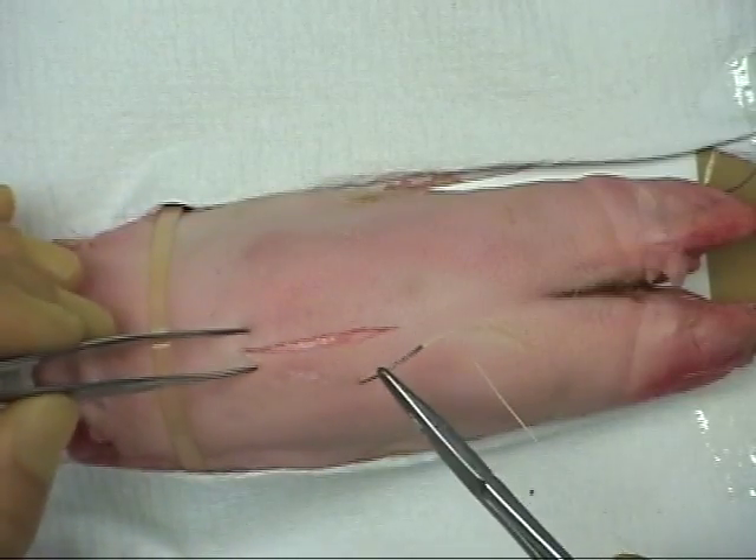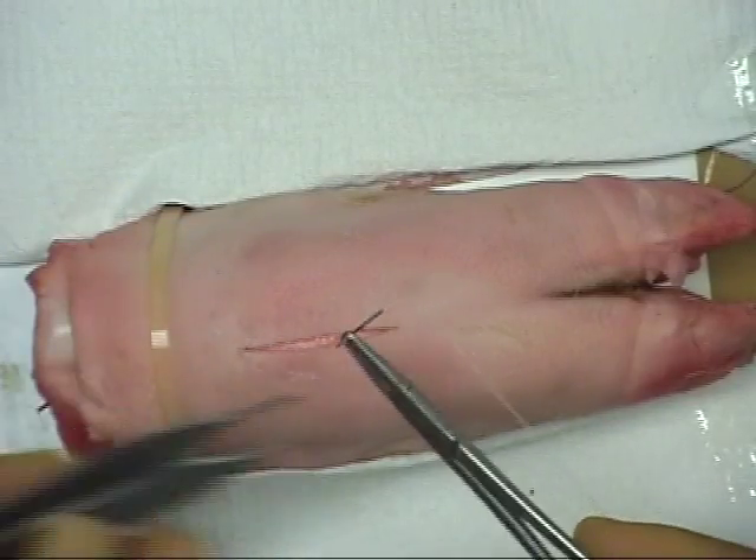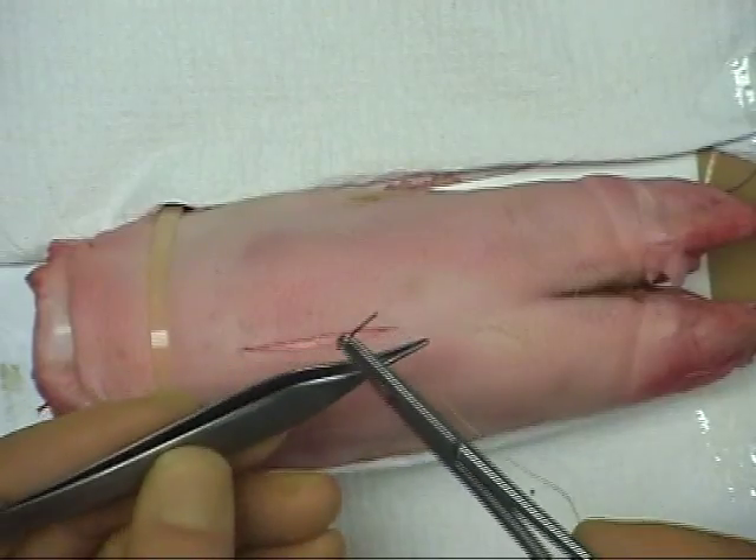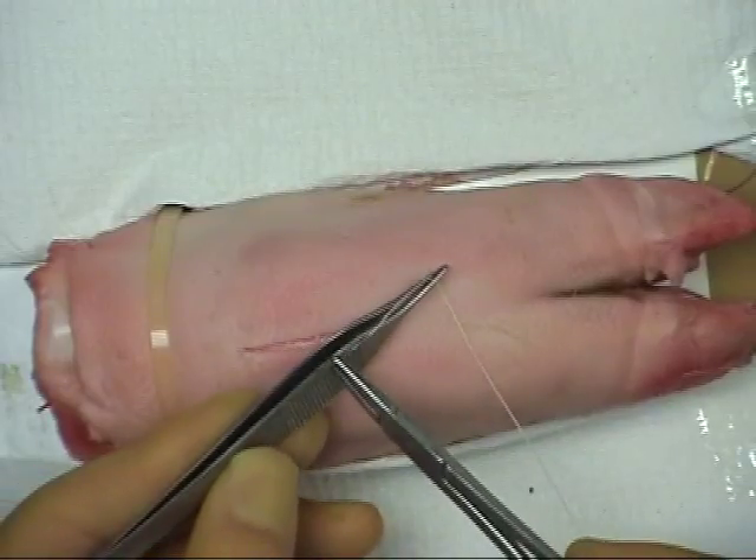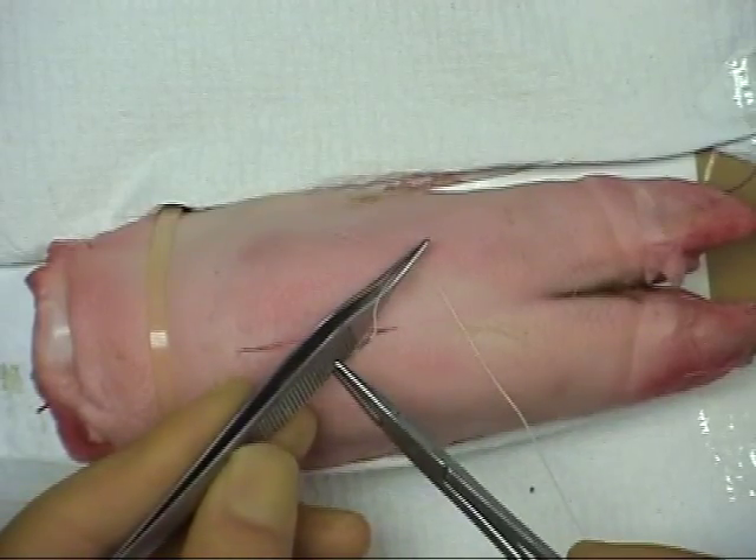The aim of this technique is to close a wound in such a way that no suture is visible on the skin surface. An absorbable, undyed suture material is used for increased cosmesis.